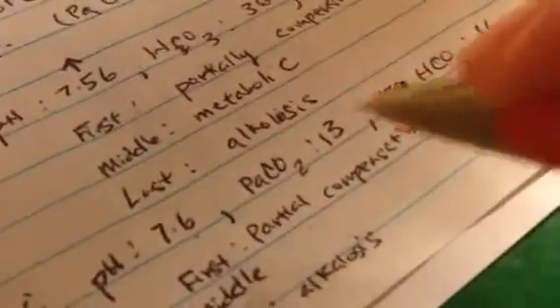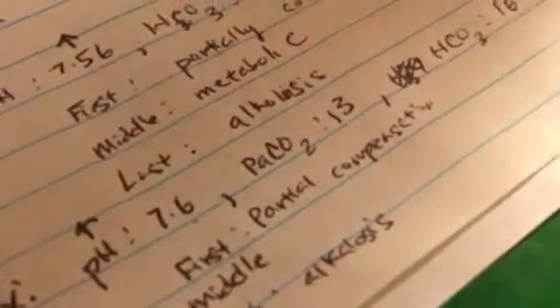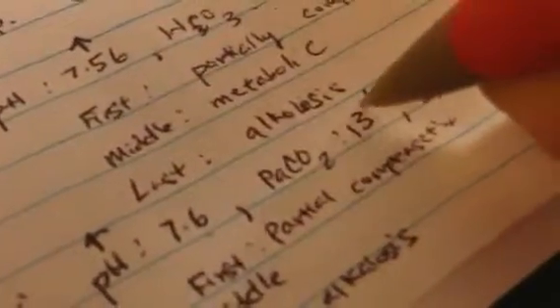Okay, so now let's take a look in more detail and compare the pH to the PaCO2, and again the pH to the bicarb. We know the pH is increased, and we know the PaCO2 is decreased. Now the bicarb is also decreased.